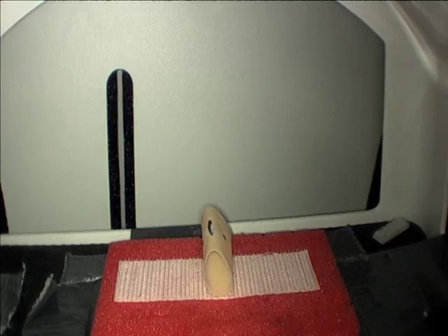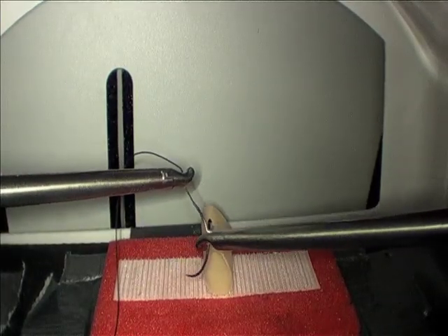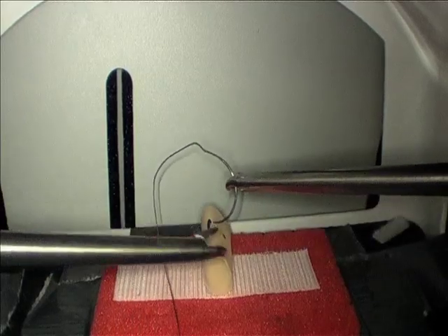Instead, just bring in the suture in your left hand, grab the needle in your right hand, and you're ready to go.